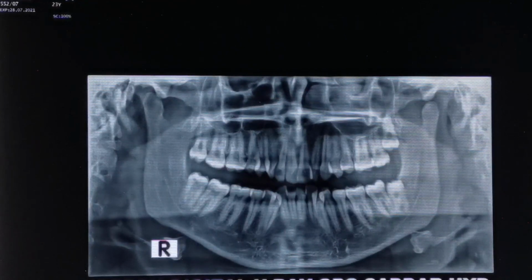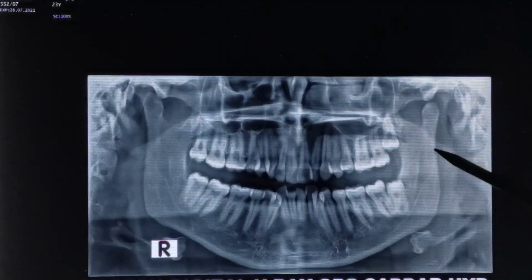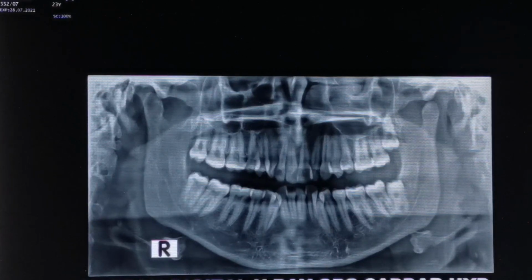Mandibular fracture, okay? What kinds of fractures can a surgeon see? For example, if there is a fracture in this region, it is a condyle fracture, or in this region, a ramal fracture. Here, if they can see the fracture, this is the angular mandible fracture, symphyseal fracture, body fracture, or any different kinds of fractures like pathological fracture or comminuted fractures.